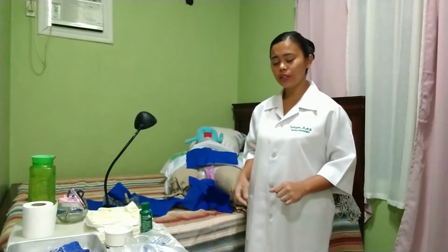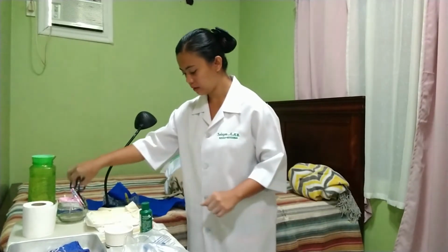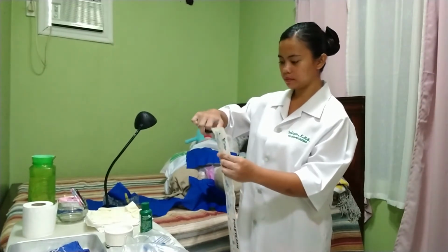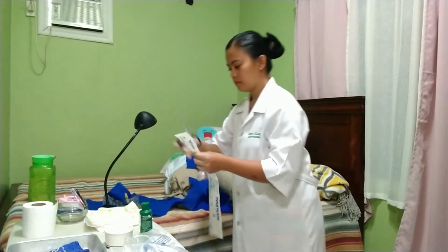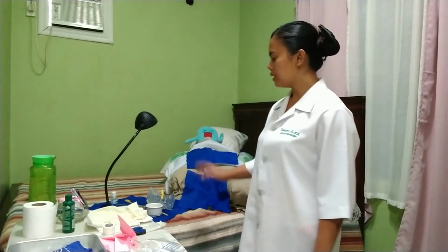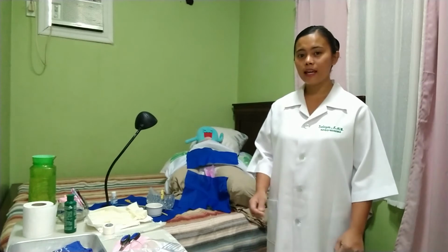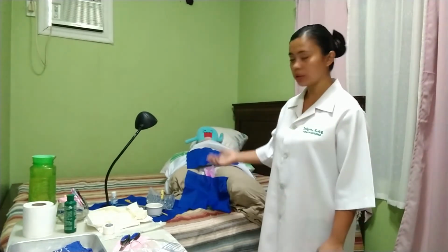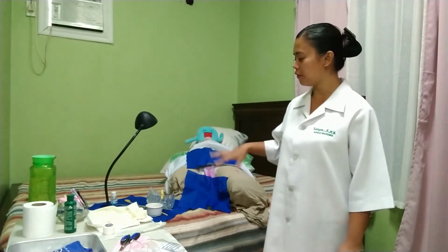Then, the next thing to do is to open our urinary catheter package and drop it on our sterile field. Then we can arrange the additional materials that we will be needing, taking care of our sterile field not to contaminate it. We may now open our cotton balls and, observing the sterile technique of opening it, allow it to drop over the container that we have in our sterile field. Remember, we need to protect the sterility of our field.